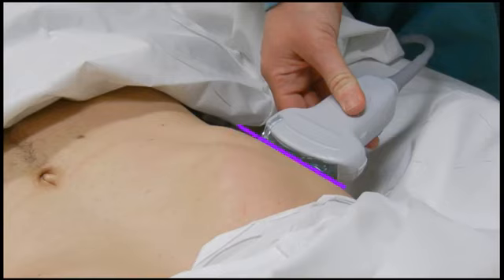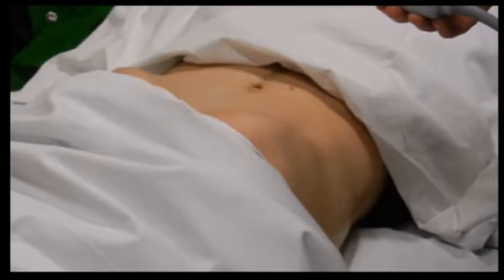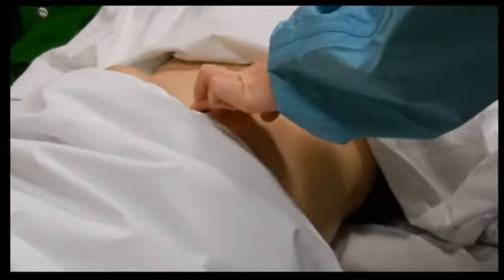The probe is held in a relaxed manner, supported underneath by your 4 fingers and balanced on top by your thumb. It is easy when first starting to hold the probe very tightly, but this is not necessary. As this scan is done in the longitudinal plane, the probe marker will always be towards the patient's head. Remember to keep your hand balanced and always move in only one plane at a time.